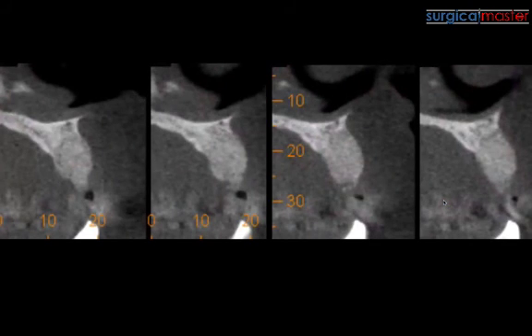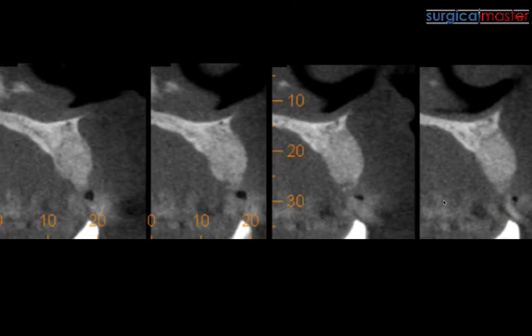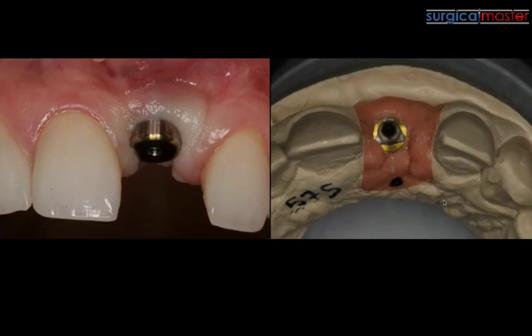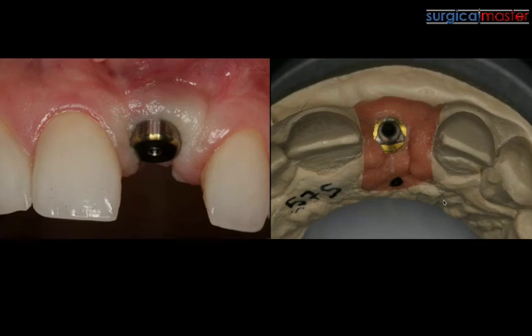Once this site is healed, you can see that although this was a tremendous defect, it healed extremely well and we're getting good implant positioning. But because I advanced the tissue, the tissue is somewhat compromised. I want you to learn from my mistake in this case—not to advance the flap. Keep it open, keep the natural soft tissue architecture so you can have great results.